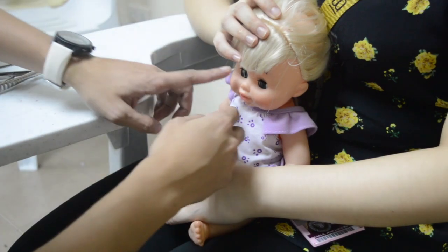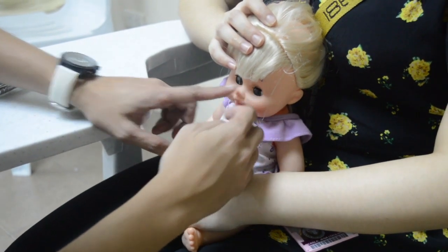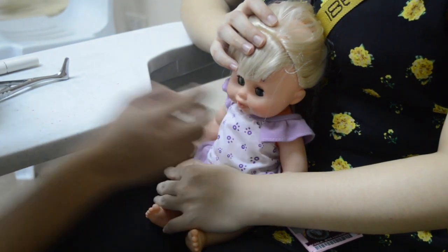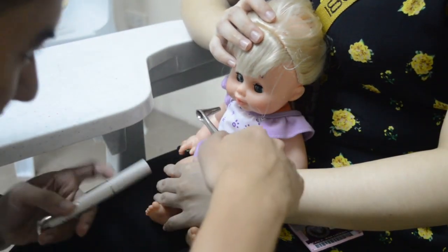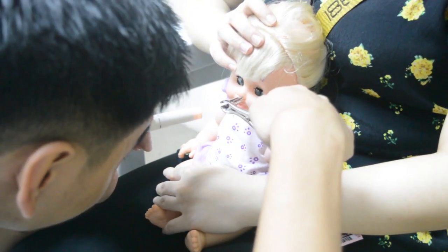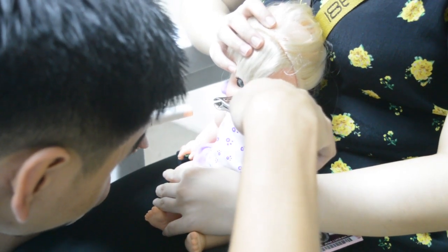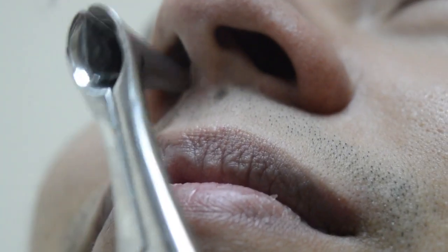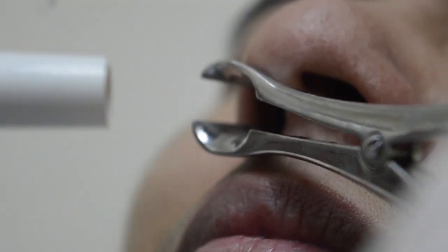Examination of the nose and sinuses: inspect the area of the nose and note for symmetry and presence of masses. Test the patency of nasal passages by gently occluding one nostril while holding the infant's mouth closed — if there is an obstruction, it may indicate choanal atresia. Repeat the procedure for the other nostril. Check if the nasal septum is midline, then insert the nasal speculum and check the internal mucosa. The sinuses of the infant are not fully developed aside from the ethmoid sinus; therefore, palpation of the sinuses is not entirely helpful.